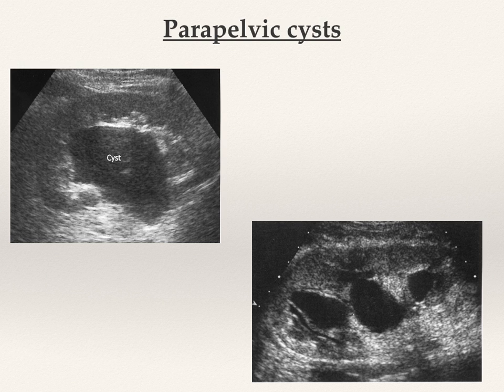So looking at the cysts, these are the parapelvic ones, and all that they're getting at in terms of parapelvic is that they still find themselves within the pelvis there. So you can still see a hyperechoic portion of the pelvis around them. They tend to be circular or kind of roundish, as opposed to the irregular shape that hydro would have. And hydro will tend to follow out into the major calyces, the minor calyces, and then up into the cortex as well.